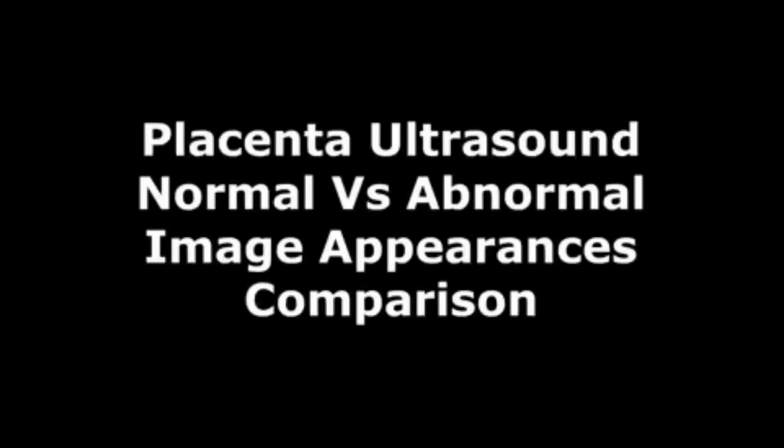Hello everyone, and today we will discuss the ultrasound appearances of placenta.